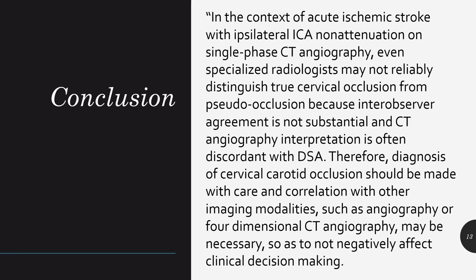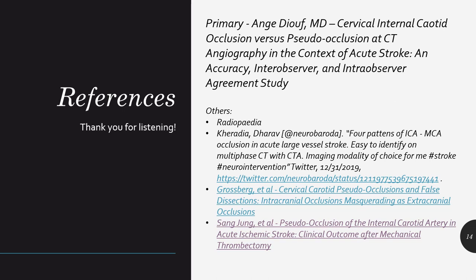Therefore, diagnosis of cervical carotid occlusion should be made with care, in correlation with other imaging modalities such as angiography or 4-dimensional CT angiography, so as to not negatively affect clinical decision making.